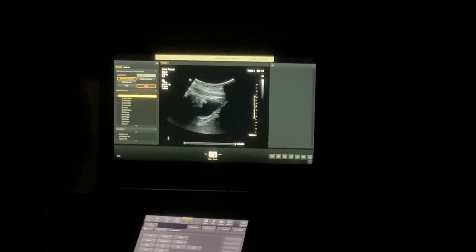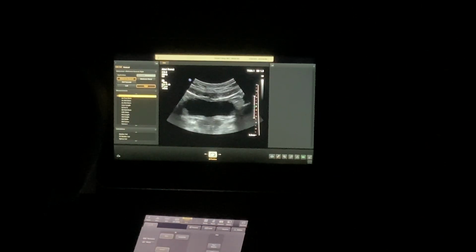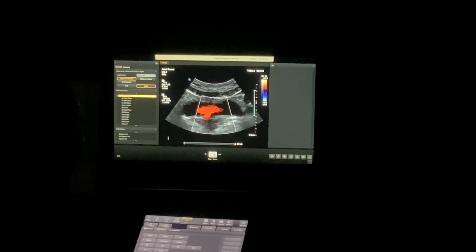Okay? So, that being said, jets. I don't know if I'll get jets on you because your bladder's not real full, but if you've been hydrating, maybe. Ah, there we go. That's a jet. Do we want to tell the patients when we call them to say, try to have somewhat of a full bladder? Yes. Somewhat. I mean, you're not going to get counted off if their bladder is little bitty. Just represent it accurately. Okay? So you don't have to have a full bladder. It just will help to see jets when it's not completely empty.